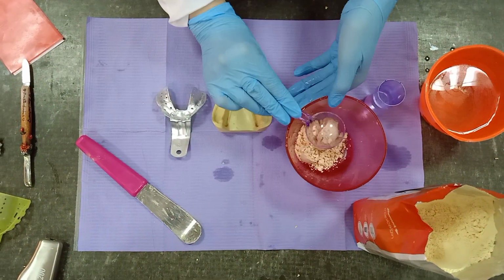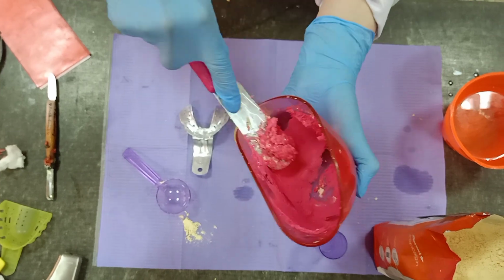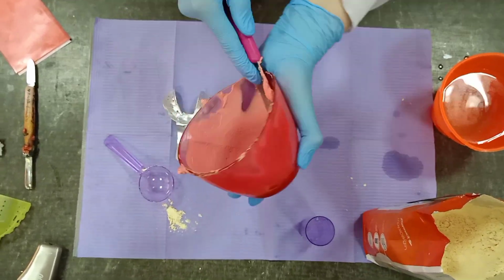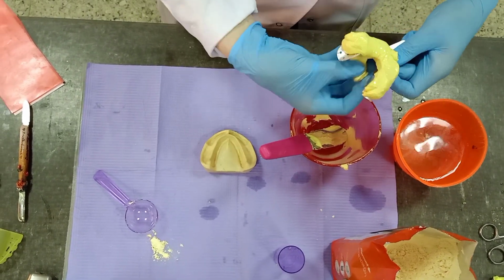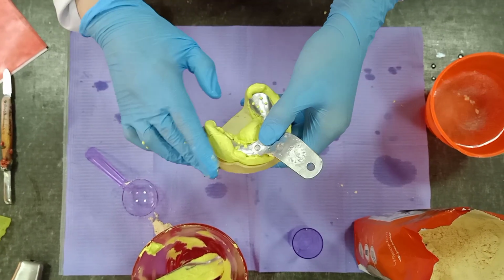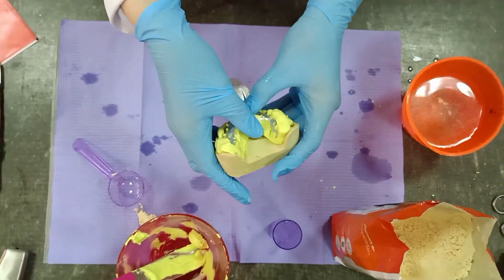And for the lower impression, we are going to do the same steps, the same mixing steps, and the same order in taking the impression. As you can see, the mixing against the rubber bowl until the color turns into orange, and then take your creamy mix into your tray, make it smooth, place it on the cast. Be sure you are pressing from posterior, then anterior. Don't forget the tongue side, and do the trimming as in the upper.